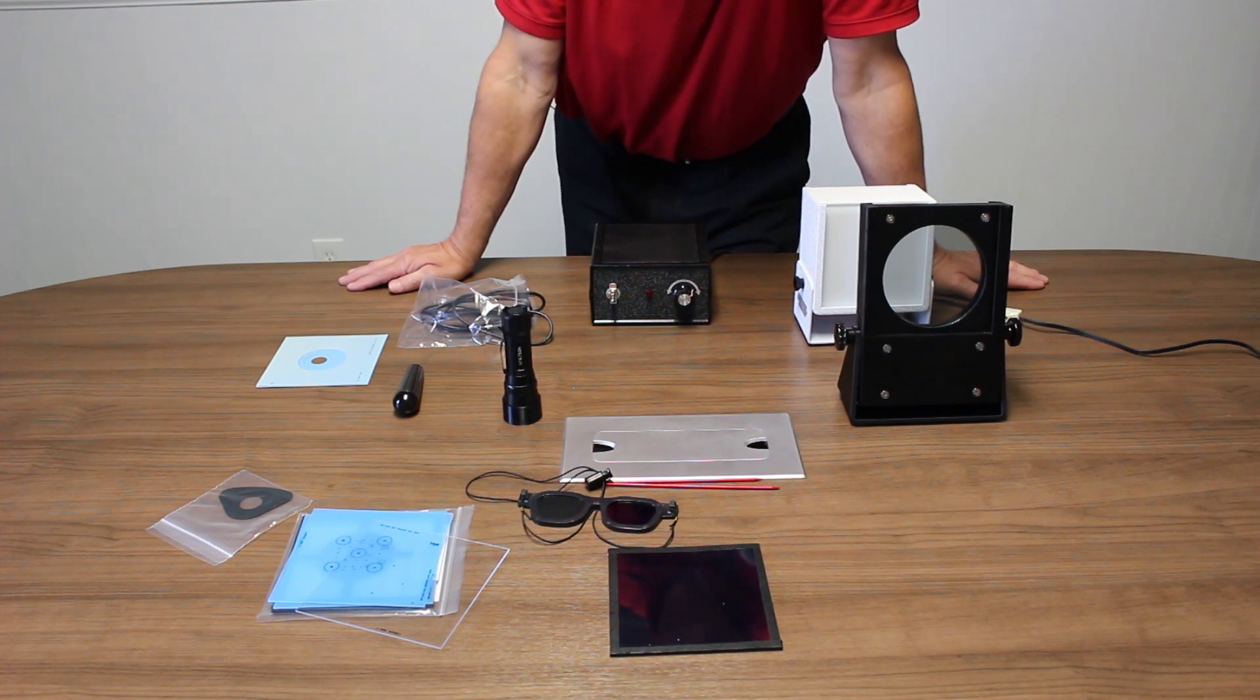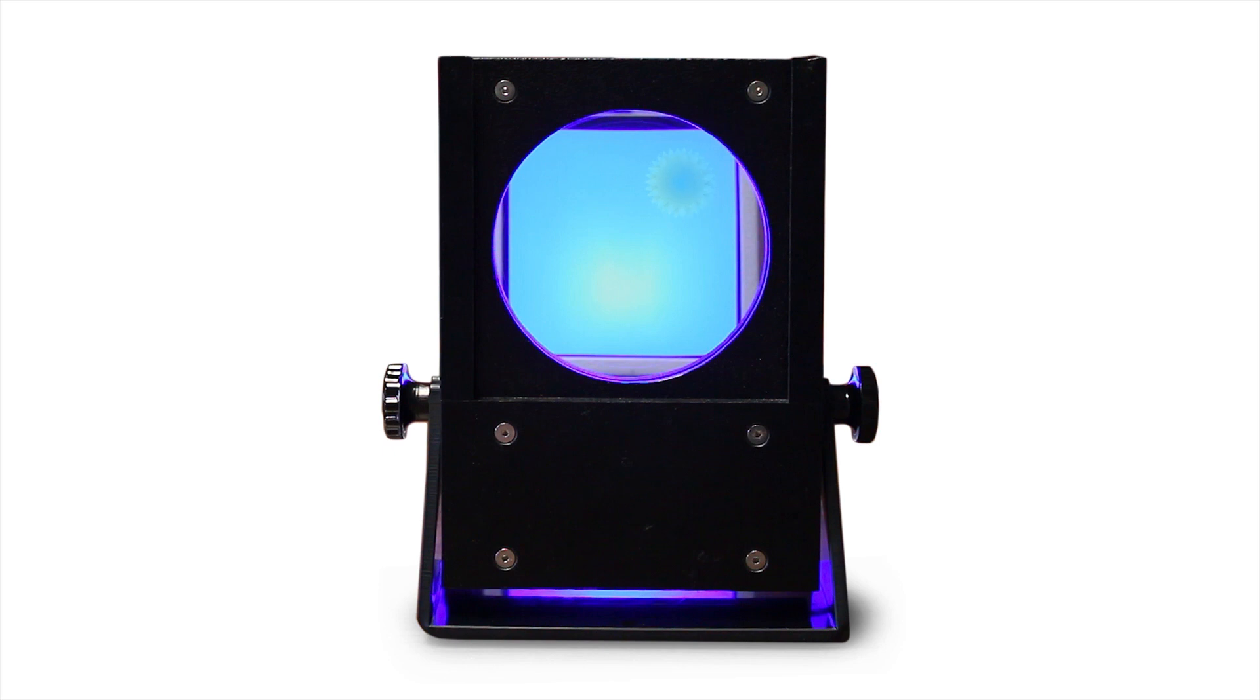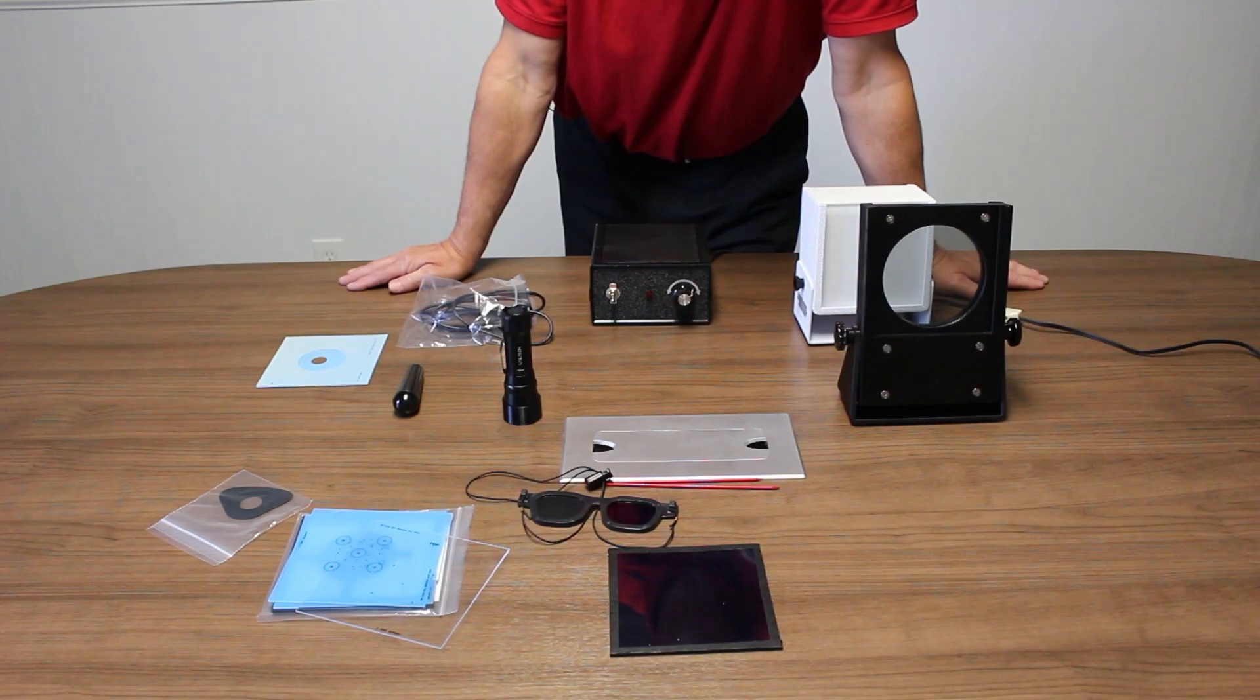Because the macula has yellow pigment in it, when we rotate a Polaroid through a blue or cobalt blue filter, we get what is called a Hadinger Brush, which basically looks like a brush or a propeller that spins around the fovea.